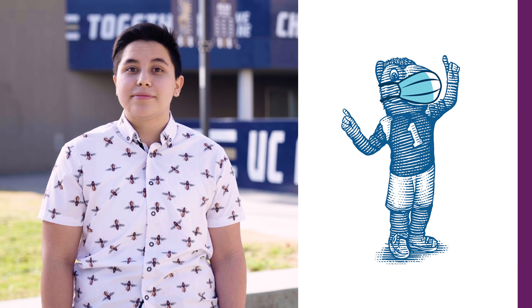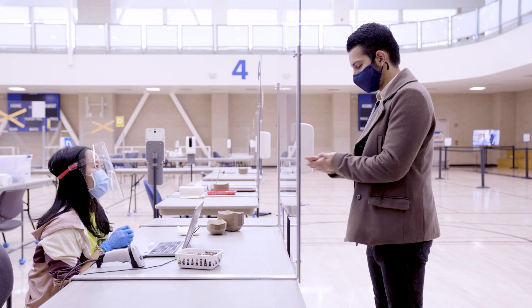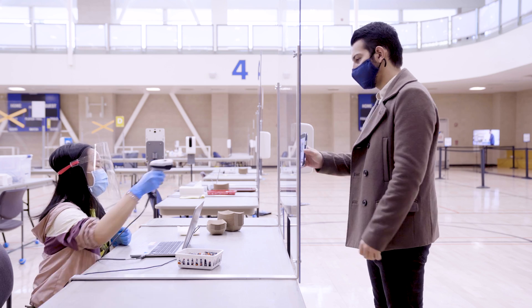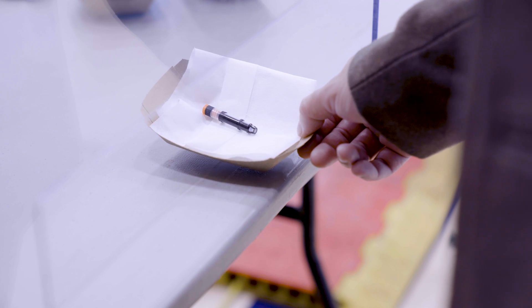When you arrive at the testing location, follow physical distancing guidelines and keep your face covering on except when submitting your saliva sample. When it's your turn, use hand sanitizer before approaching the registration tables. The attendee will scan your QR code and provide a small vial with a unique barcode that's linked to you.